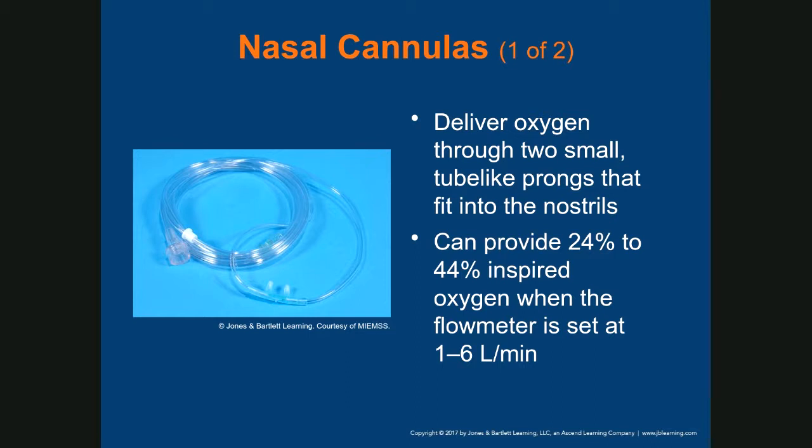And that will give you about 24 to 44%. Now, for test purposes, the range is 1 to 6 liters, right? So that's the textbook answer to the question.